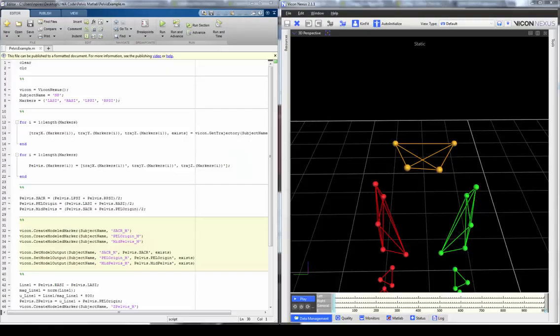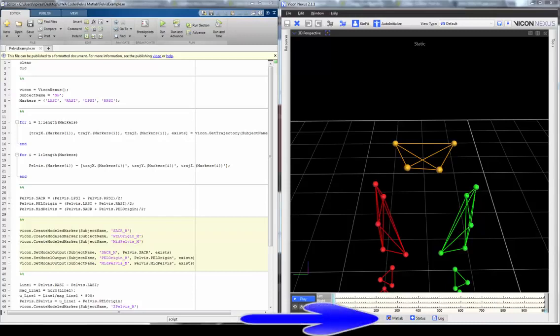Nexus 2 allows direct interface with MATLAB. This allows the user to directly edit the C3D file within Nexus, as opposed to having to export the data to an external source. A few of the things we can do is filter both trajectory and analog data in MATLAB, set gait cycle events, and do biomechanical modeling directly through the Nexus 2 MATLAB interface, amongst other things.